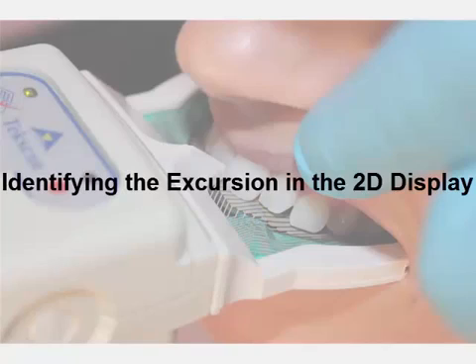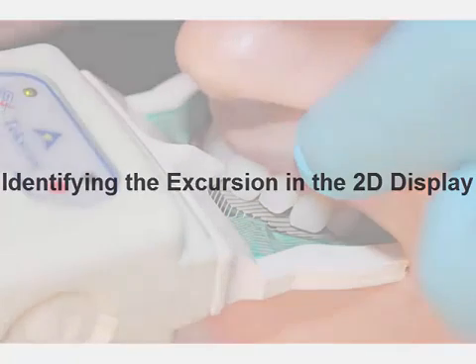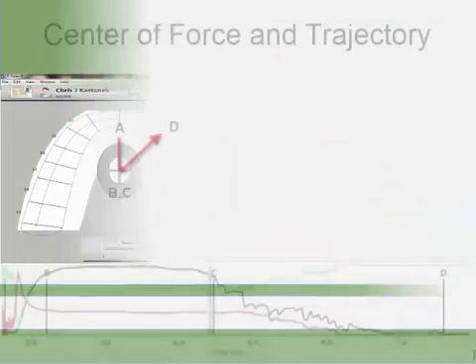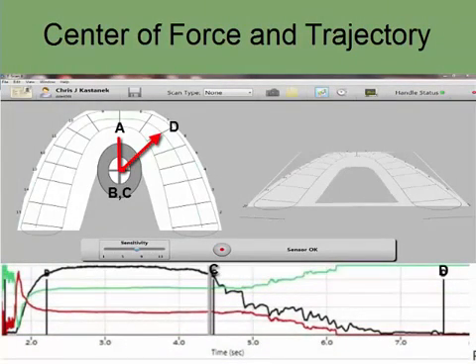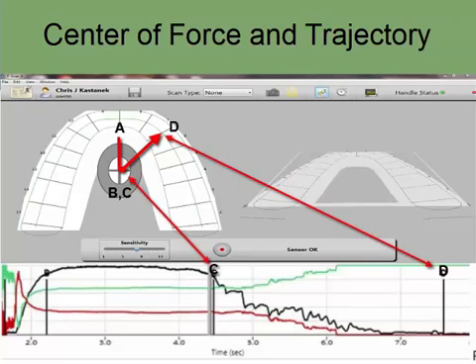The center of force trajectory can give the dentist an idea of whether or not the patient has good anterior guidance. The anterior guidance patterns begin at the C line and end at the D line of the graph.